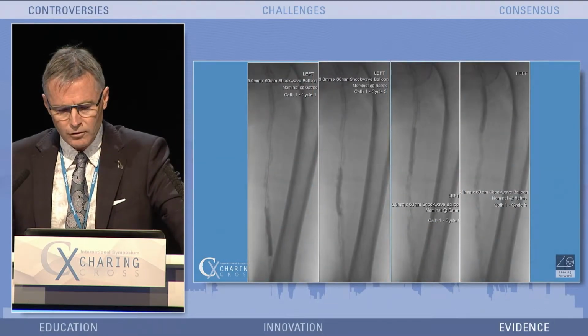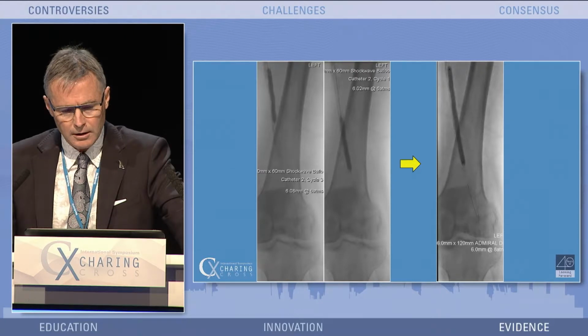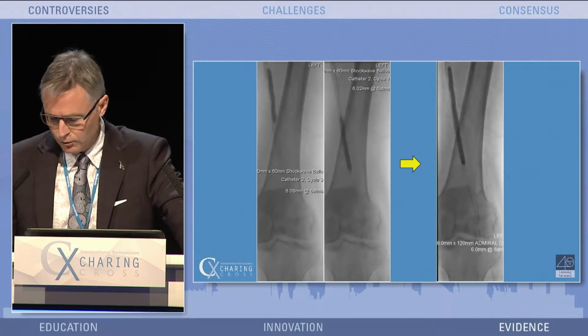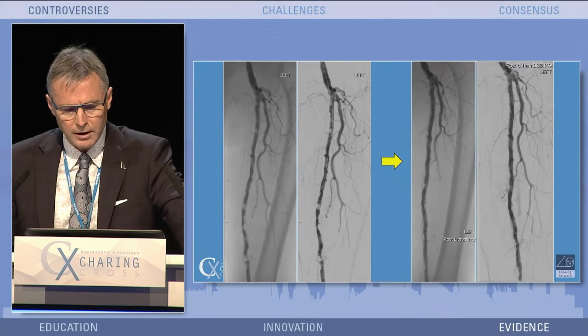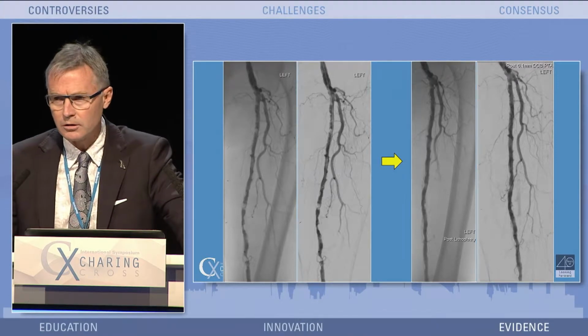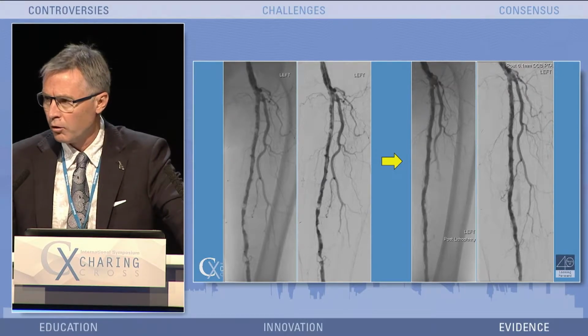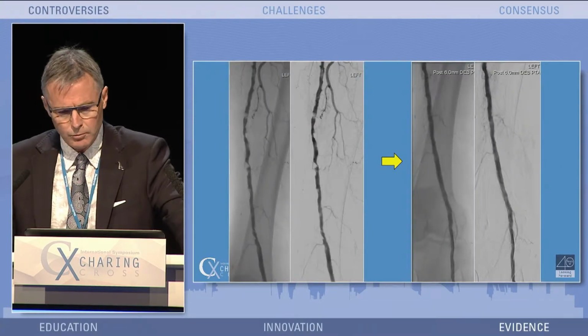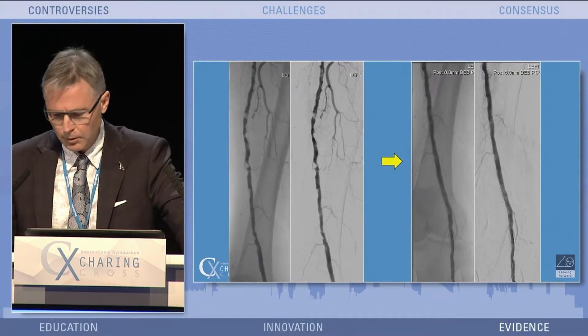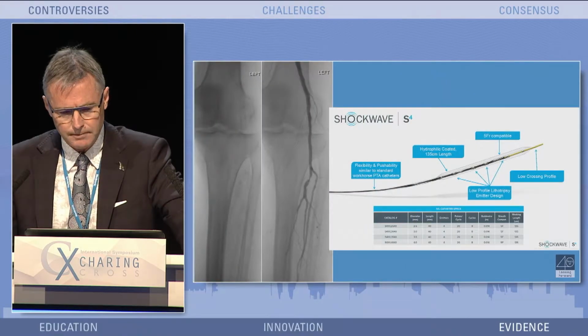And we performed intravascular lithotripsy right through the popliteal, the superficial femoral artery, and the above-knee popliteal artery, and followed that with drug-coated balloon angioplasty. And this is the kind of result we obtained before and after, and to the question of needing a stent. I mean, this would be the kind of case you'd be thinking you'd reline the whole thing with Supera. This is what we got purely with the balloon-based technology. There you see again in the popliteal, in the distal superficial femoral and popliteal arteries.